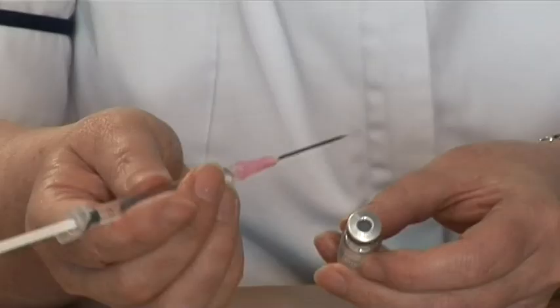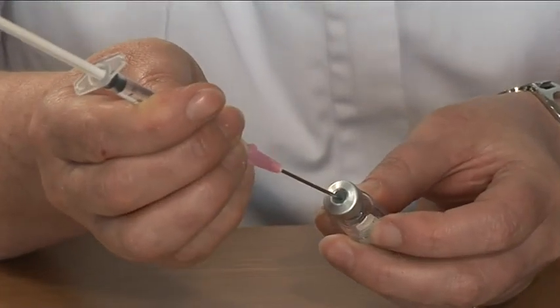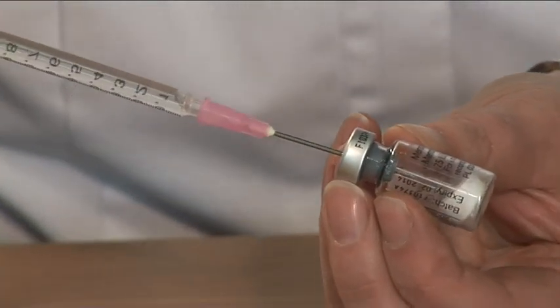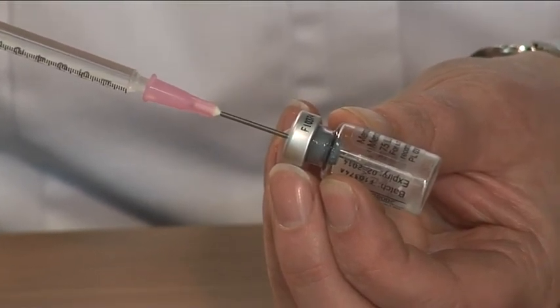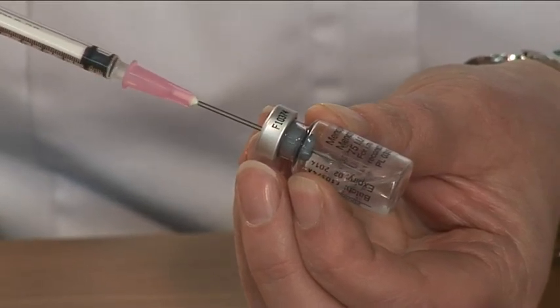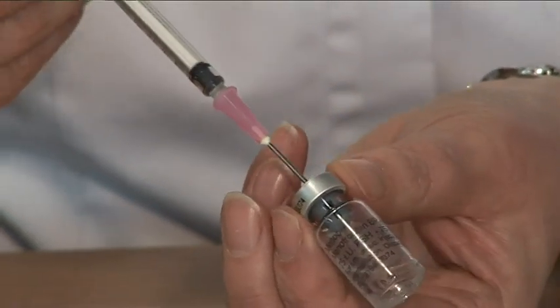Take the syringe and pop the needle through the very centre of the rubber bung and push the plunger slowly down. As soon as the powder gets wet, it dissolves, so you should now have a colourless liquid in your vial. Check the vial carefully to make sure all the liquid has dissolved.